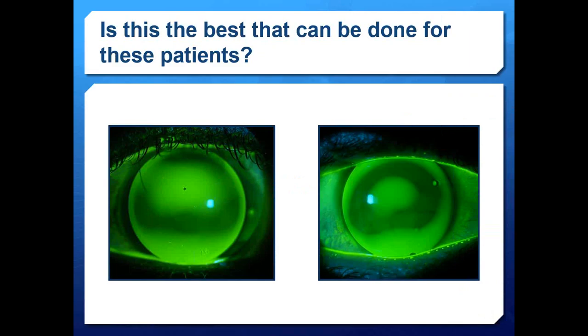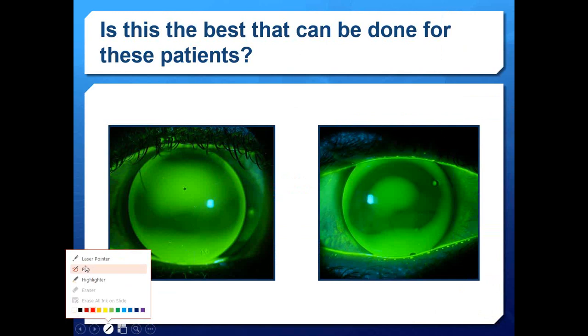It's interesting to me how I've really changed in how I look at contact lenses, and especially cases like this where I really believed that it was possible to find a rigid lens that could fit every eye. It has turned out to be very foolish to think that we could possibly fit an eye that has so much asymmetry.